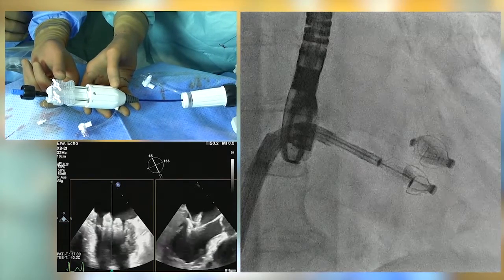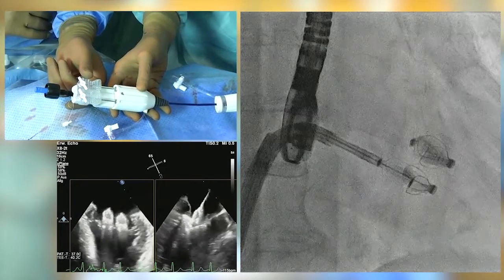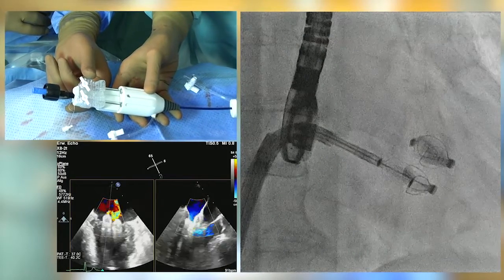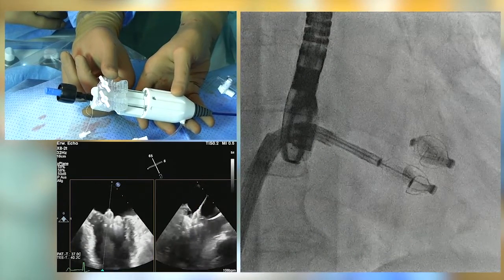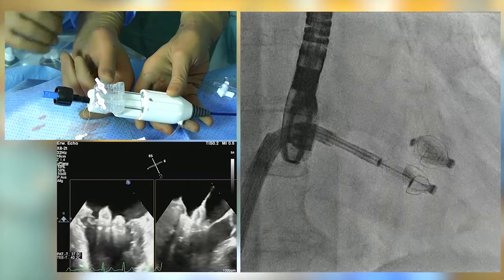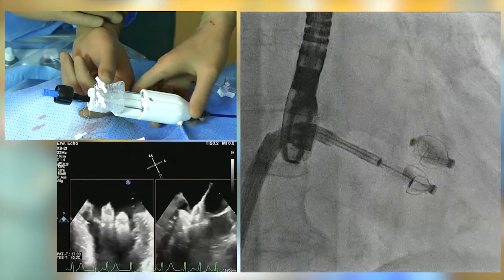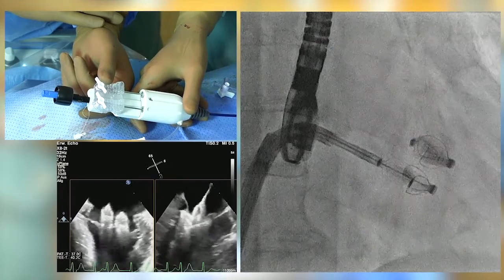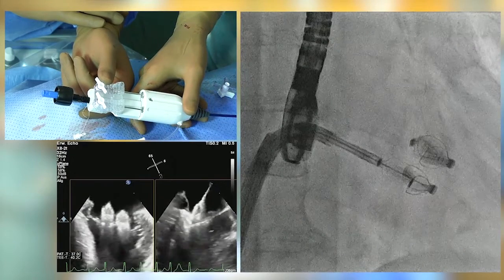And then we go back to X-plane view. For the implant, we have the two leaflets on. Now remember, the aim here was to have the leaflets nicely on, but not pulling too hard on them to avoid the risk of a gradient which is not acceptable in the end. So both leaflets are on. When they're both nicely on, then our default approach would be simultaneous grasping.